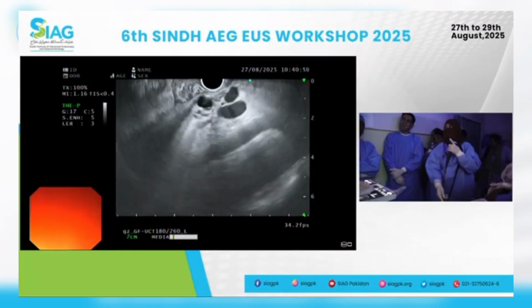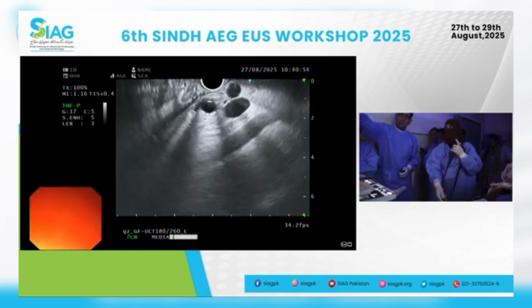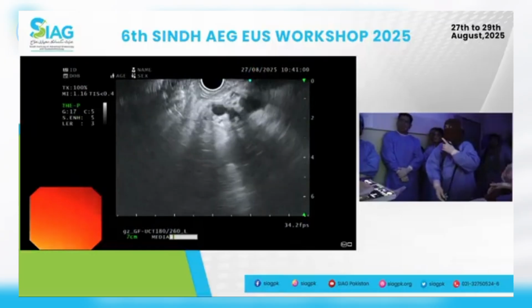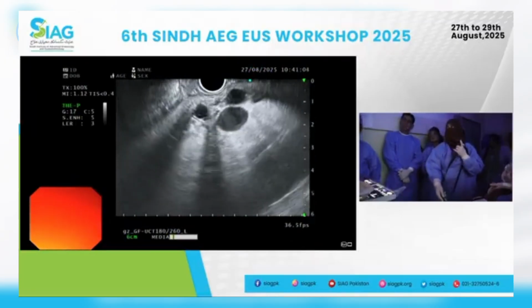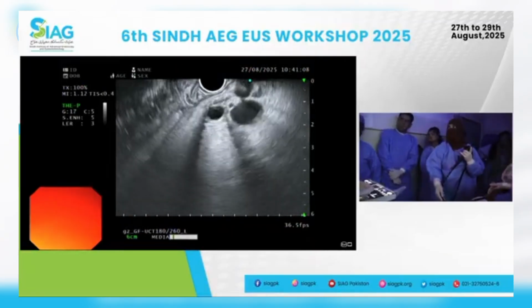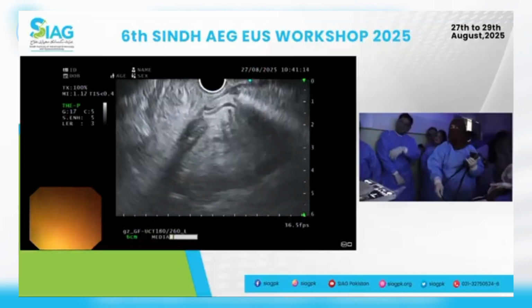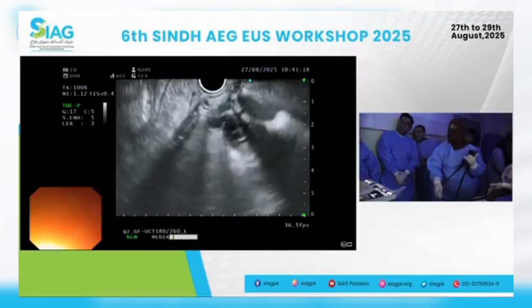That's fine. You've gone back to the aorta with the celiac and the SMA. So let's go back again to the neck of the pancreas where you were before. Focus on the neck. Good. Follow it toward the neck of the gland, or you can look at the splenic vein and see where it joins the portal vein confluence.